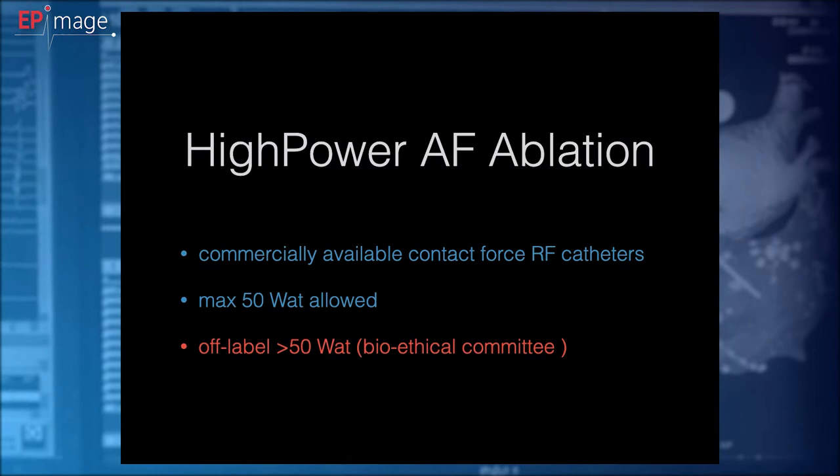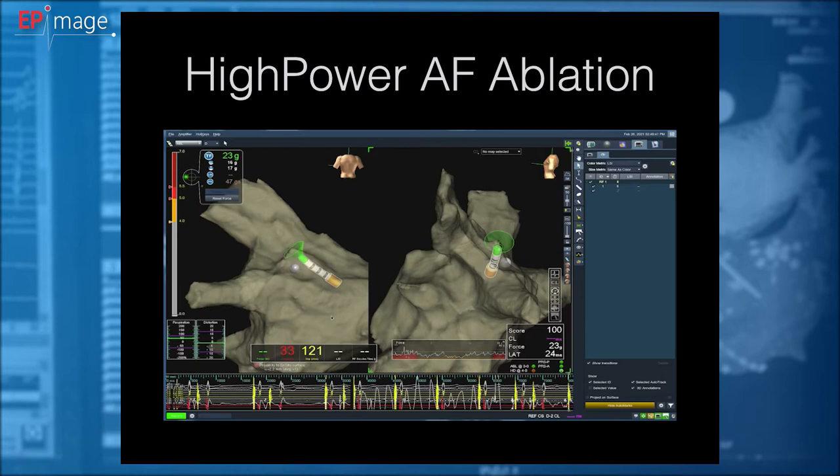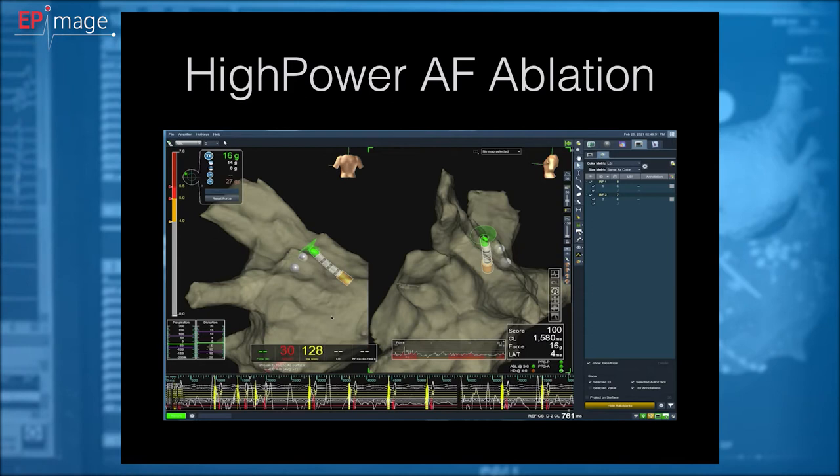What you see now is the beginning of ablation on posterior wall of left atrium, close to left pulmonary veins. I'm using the TactiCath ablation catheter. I'm on EnSite Precision. What you see is ablation with 50 watts. It's really, really fast. A single application lasts just a few seconds.